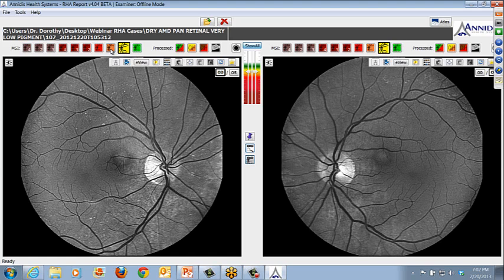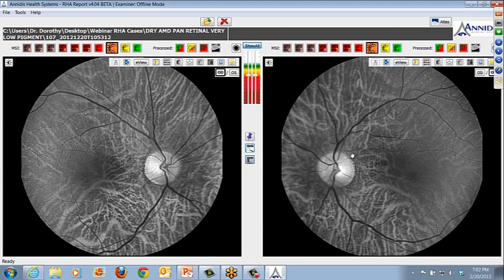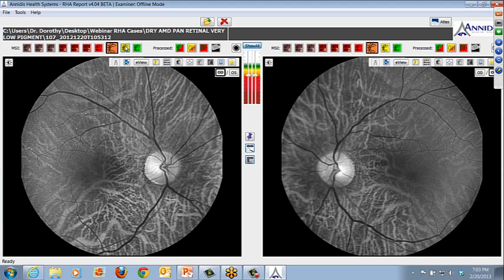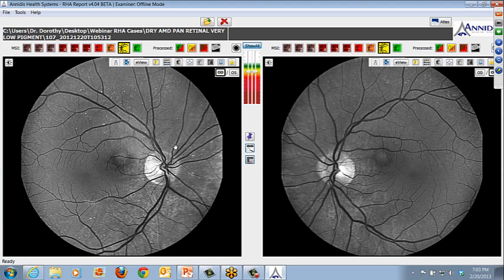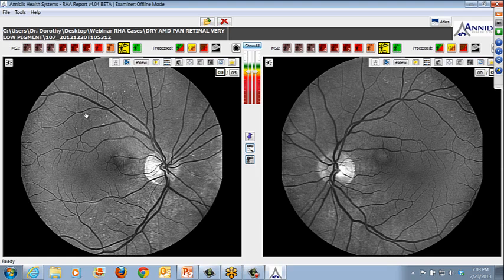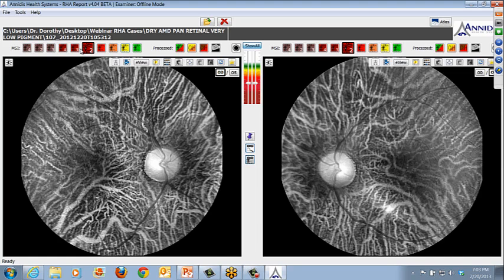upper LEDs. You can actually see choroidal vasculature in pretty good detail as you head into the amber view, okay? And toggling between yellow and amber, you're going to see that the hard drusen are most hyperreflective around this level here in the arcades of both eyes. Okay, we'll move down into the reds.